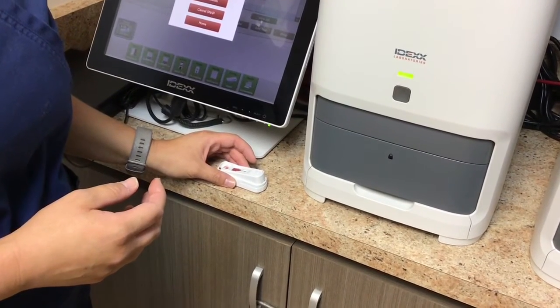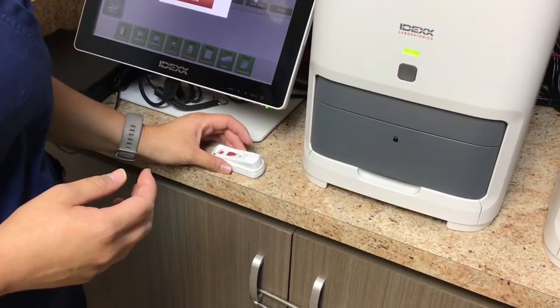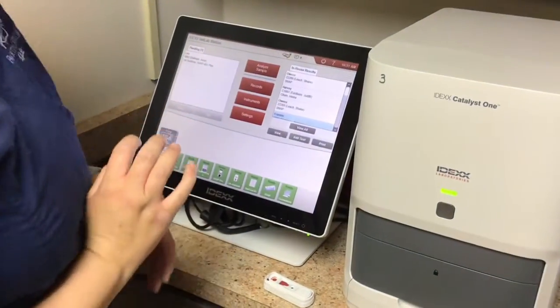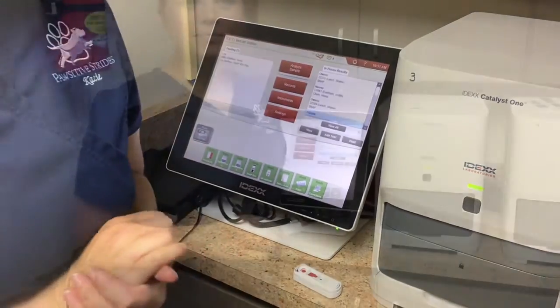I don't see anything at all right now. All right, I've got that in there. I'm going to go ahead and snap it and start my timer. And then we'll come back as my timer is running for about 8 minutes.